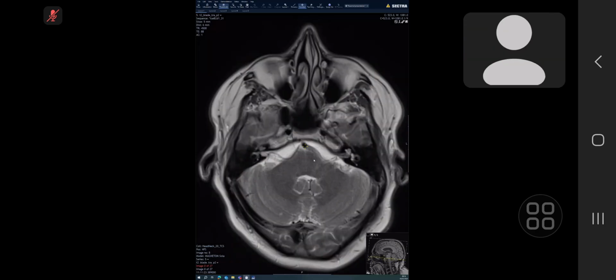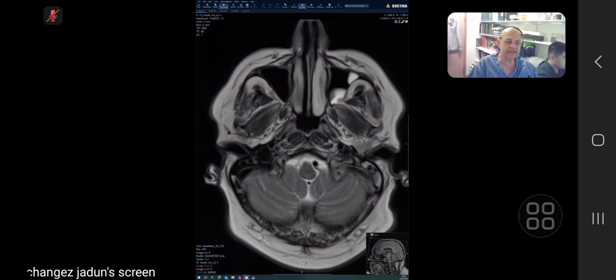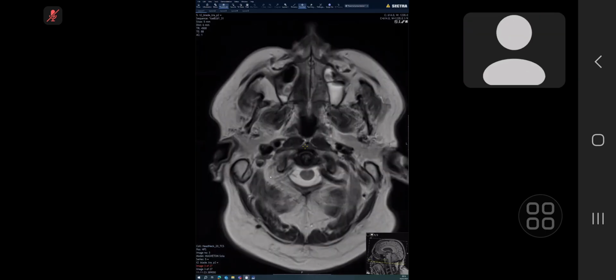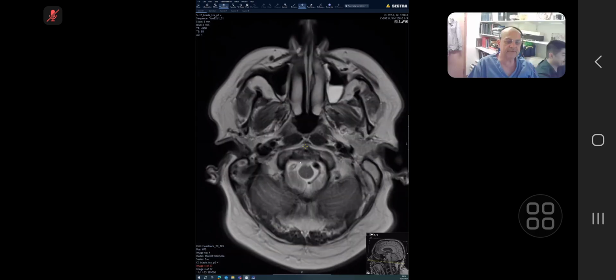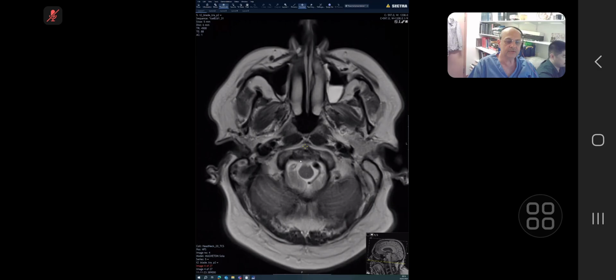Yeah. You can see the basilar, then leftward and rightward. Where is the signal in the right? There is no signal in the right vertebral artery. You can see parallel lines, but you don't see any flow void.